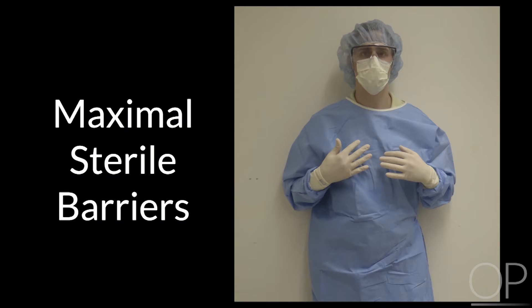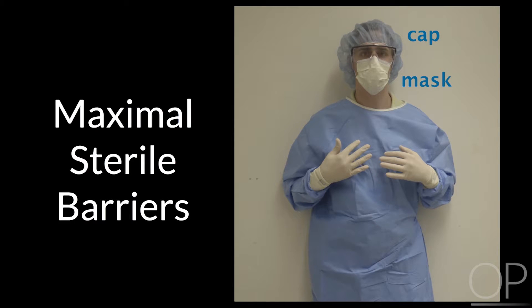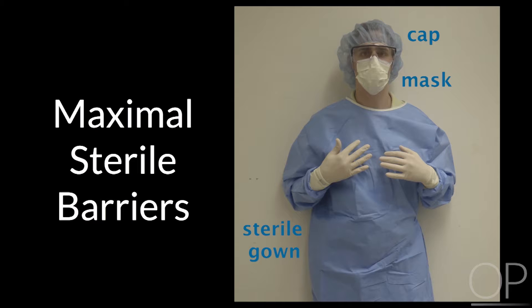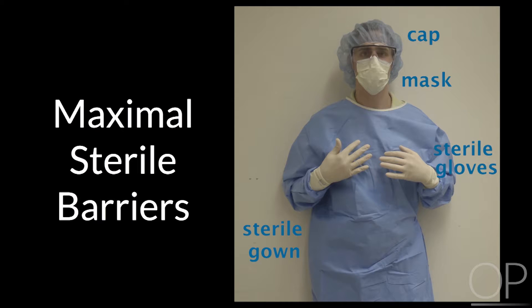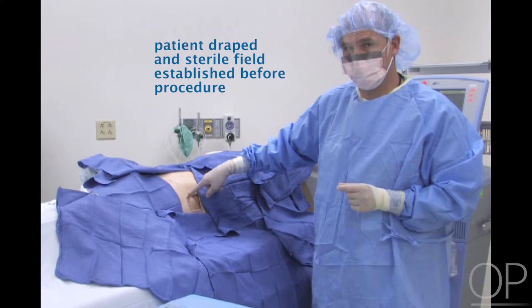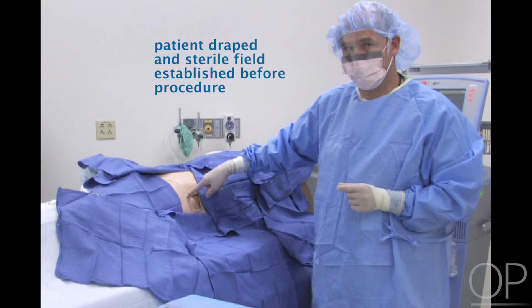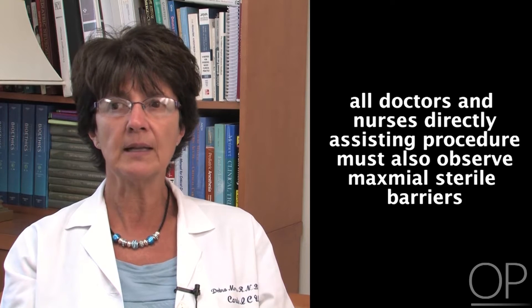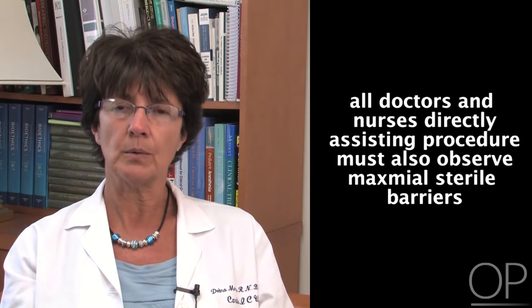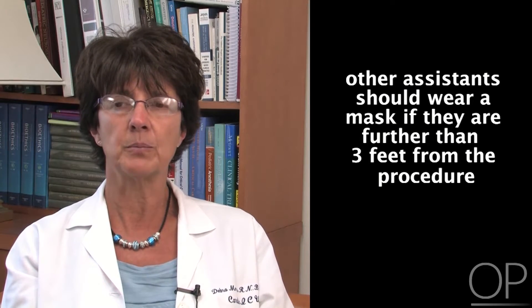Maximal sterile barriers are defined as the doctor or nurse wearing a cap, mask, sterile gown, and sterile gloves. We also include eye protection to protect the doctor or nurse from potential blood exposure. The patient must be fully draped and the sterile field established before the procedure begins. All doctors and nurses directly assisting with the procedure must also observe maximal sterile barriers. Other assistants should wear a mask if they are further than 3 feet from the procedure.